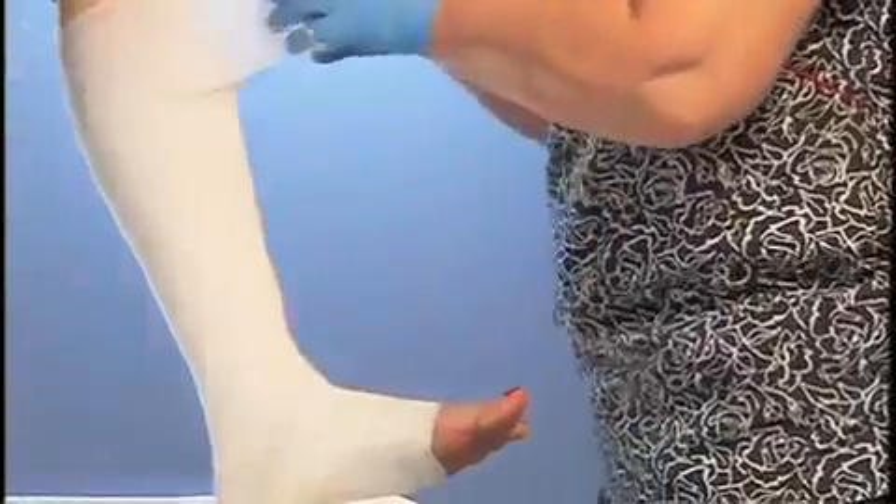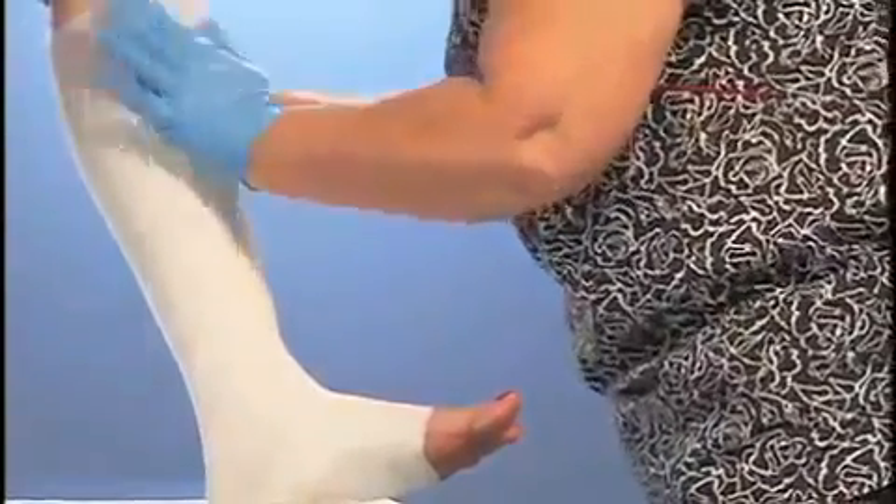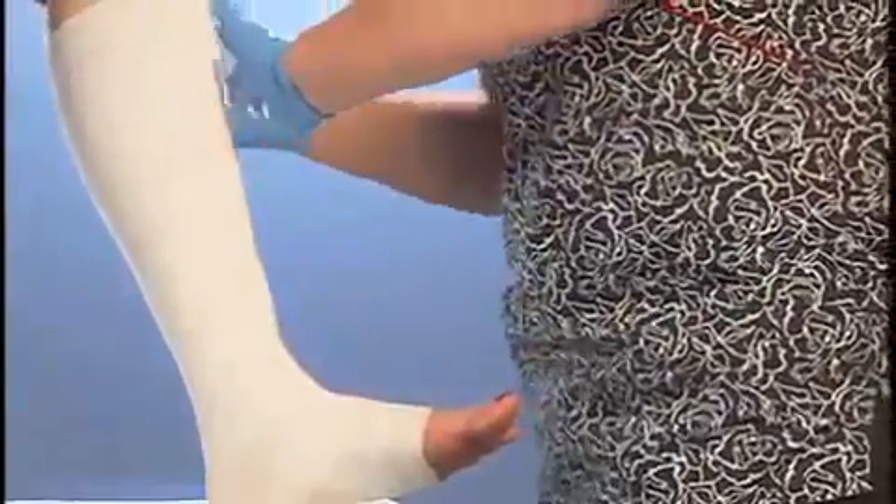As you are wrapping up the leg, smooth and mold the bandage with your hands. If needed, you can cut the bandage to prevent wrinkles, pleats, and folds. You can also restart the wrap where the bandage was cut. Continue this procedure until you are about one inch below the knee, which is one finger width below the posterior bend of the knee.